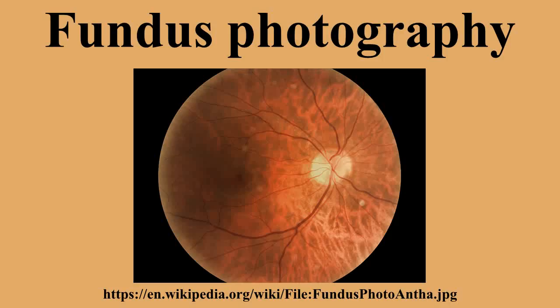Fundus camera. Optical principles. The optical design of fundus cameras is based on the principle of monocular indirect ophthalmoscopy. A fundus camera provides an upright, magnified view of the fundus. A typical camera views 30 to 50 degrees of retinal area with a magnification of 2.5x, and allows some modification of this relationship through zoom or auxiliary lenses from 15 degrees, which provides 5x magnification, to 140 degrees with a wide-angle lens, which minifies the image by half.